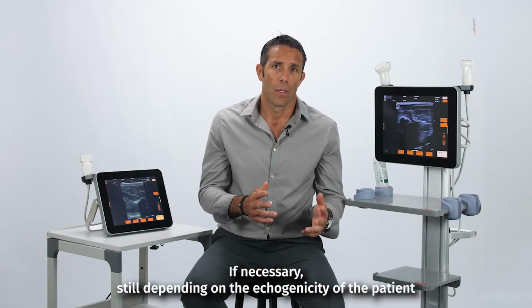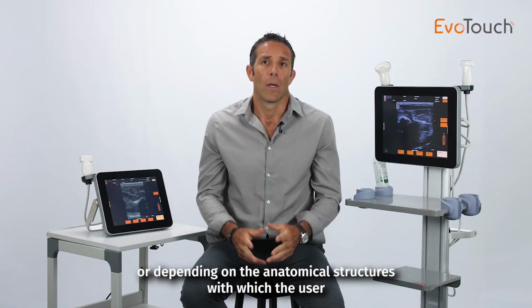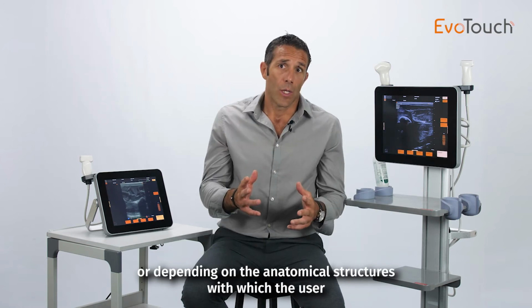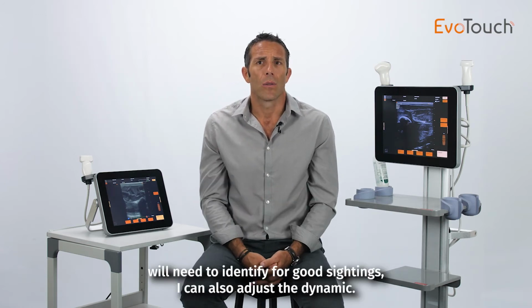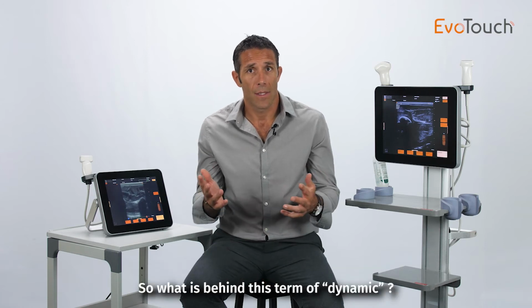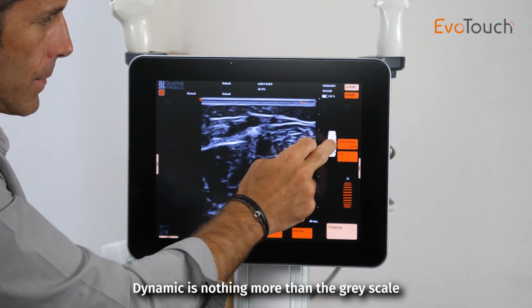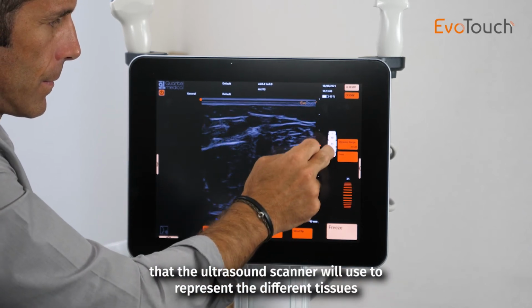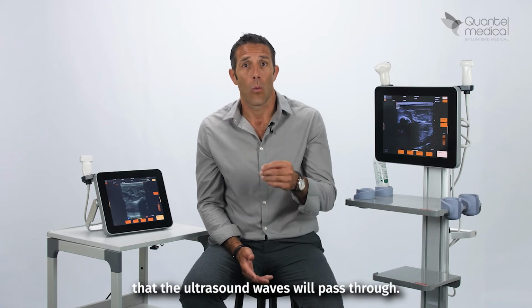If necessary, still depending on the echogenicity of the patient or depending on the anatomical structures the user will need to identify for a good sighting, I can also adjust the dynamics. So what is behind this term of dynamics? Dynamics is nothing more than the gray scale that the ultrasound scanner will use to represent the different tissue that the ultrasound wave will pass through.